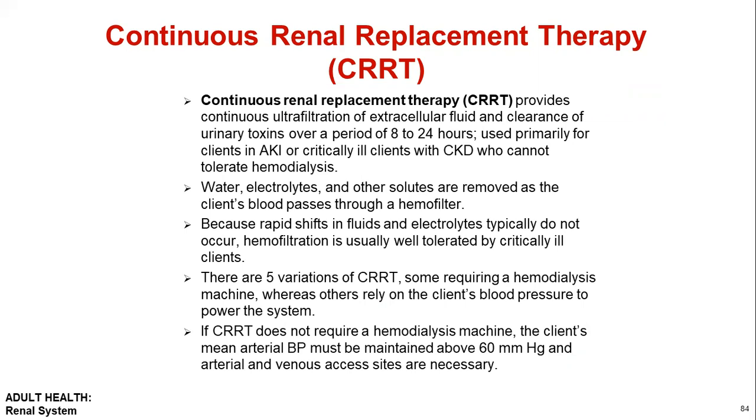Water, electrolytes, and other solutes are removed as the client's blood passes through the hemofilter. Because rapid shifts in fluid and electrolytes typically do not occur, hemofiltration is usually well tolerated by critically ill clients.